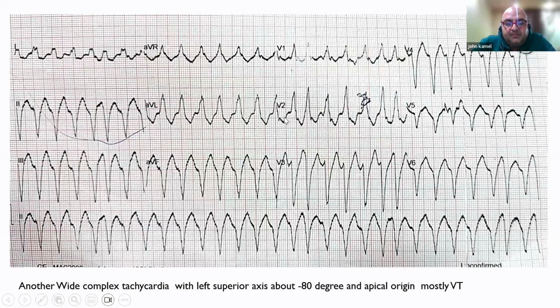So this patient also has an apical VT arising from the inferior wall. So at least we have 2 different exits of tachycardia, both sharing apical origin, one from the lateral wall and one from the inferior wall.